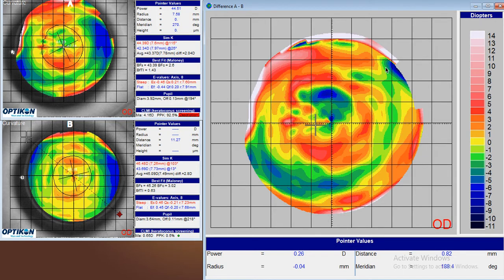And it's not sealing off too well, so there's some flattening, but not a whole lot out here. A little bit more in this area, which looks better. If we zero in on this area, what I see is more touch or more applanation out here towards the edge of the lens, and as we go towards the center of the lens, that relieves, where we're not getting as much pressure, as much flattening as we head towards the reverse curve.